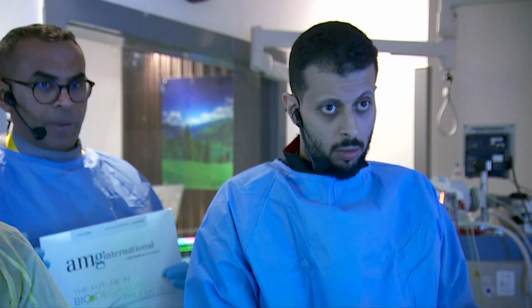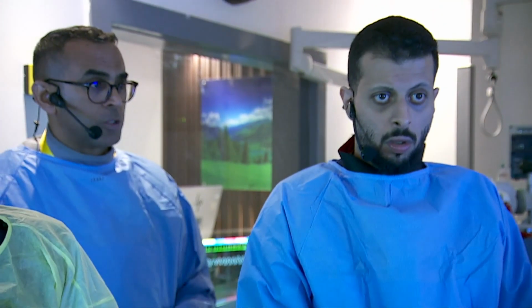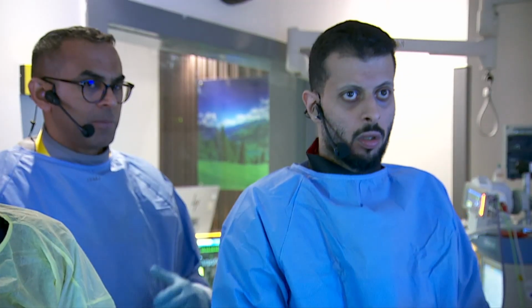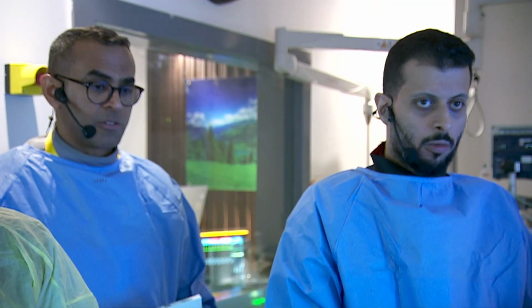For the sake of patients' preference, the team at King Fahd Medical City preferred to place a plastic stent. They did not want to go with a biodegradable for their own reasons. But it's always also an option available in case they are interested in that.